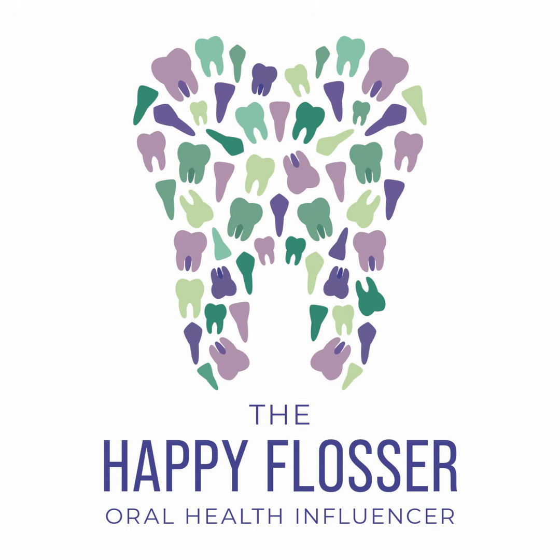Sometimes some patients have a really challenging maxillary canine because that cusp tip comes down to a point, so you have to make some adjustments in order to get the apex and have that image come out straight. Some patients have third molars that are laying down horizontally, so in order to get an image of that full tooth, it's a little challenging for you. There's all kinds of challenges.